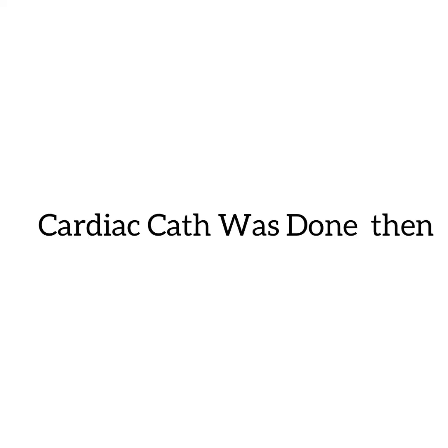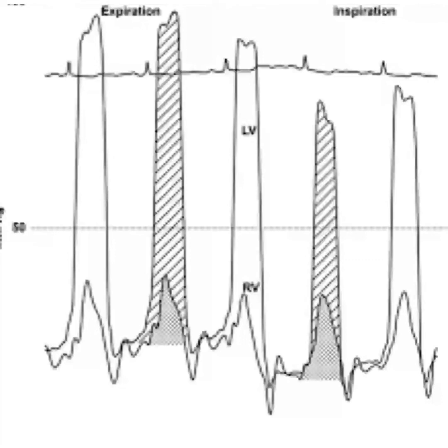The patient's cardiac cath was then done. You can see the expiration and inspiration phases, and you can see the change in the pressure clearly.